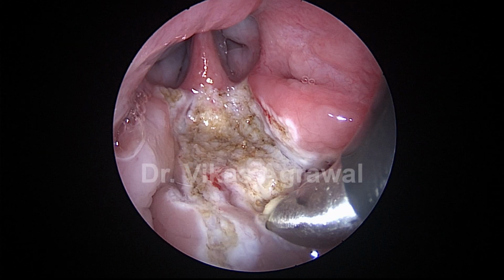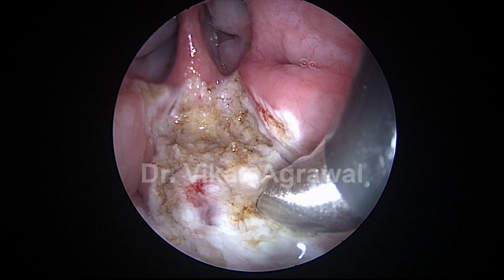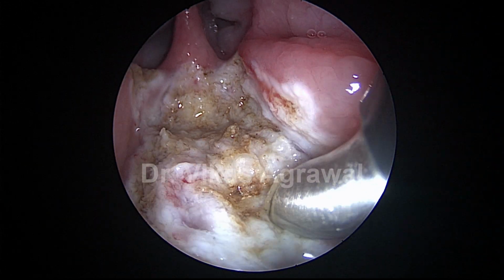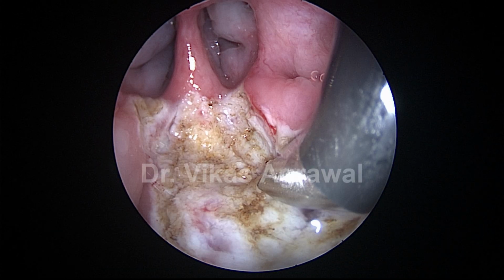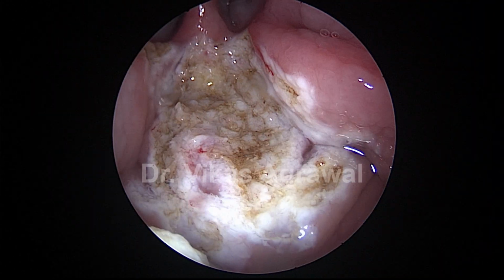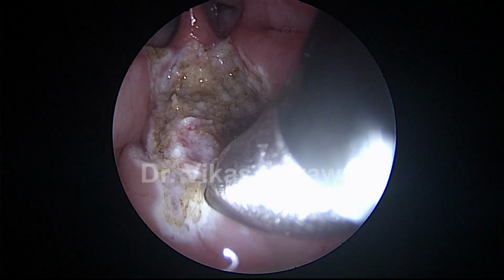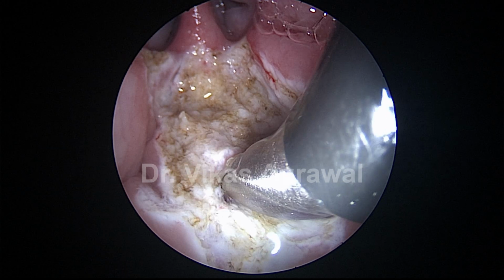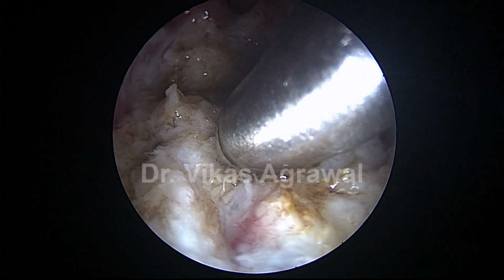When you are on the sides, you have to be very careful because there are some small vessels which come from the lateral side. So you have to be careful about that. Now I have still not seen the buccopharyngeal fascia. I do not want to open up the buccopharyngeal fascia at any cost because that will give a lot of pain to the child. I'm first removing the major bulk. That seems to be the fascia.